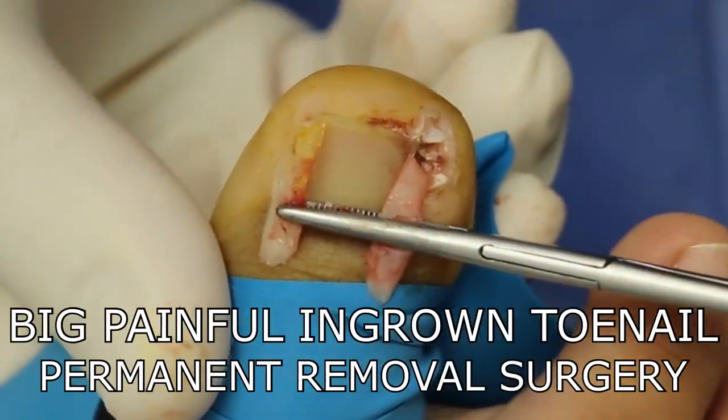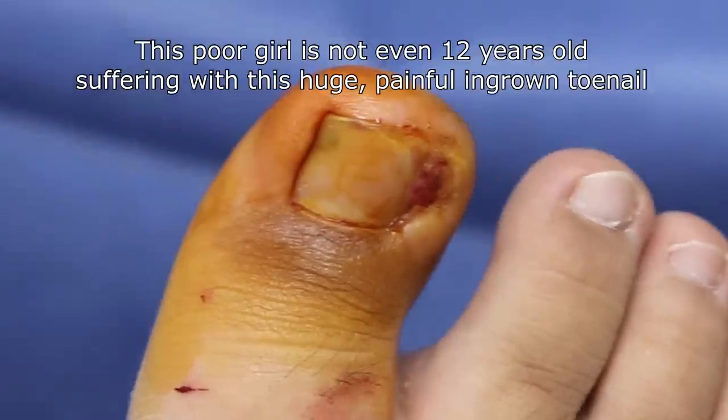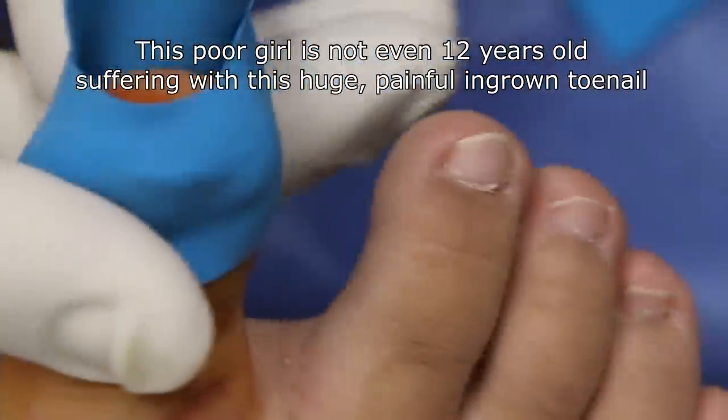See how wide her nail was? Massive. So we're going to put on a little rubber band so there's no blood and I can see everything nice and clear.